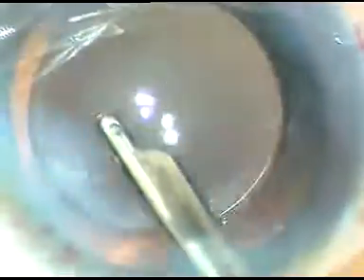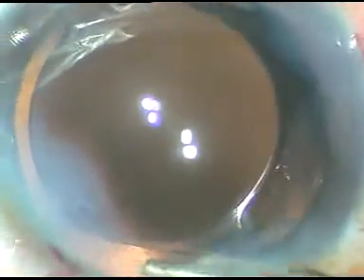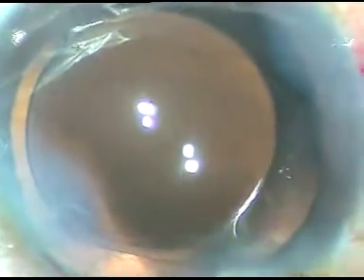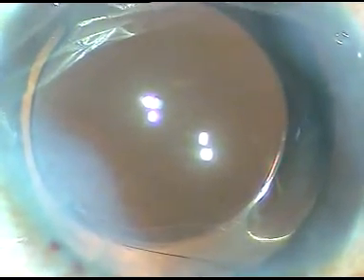Whatever I have introduced, pilocarpine, moxifloxacin, whatever, I remove most of it, because some particulate matter, some solid particles somehow enter into the anterior chamber along with these injections. That increases the risk of toxic anterior segment syndrome. So to get rid of that, I wash it out.